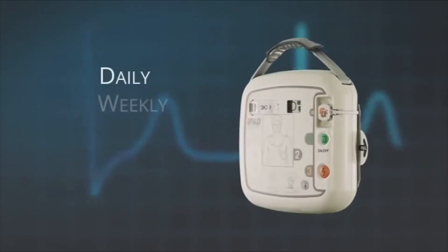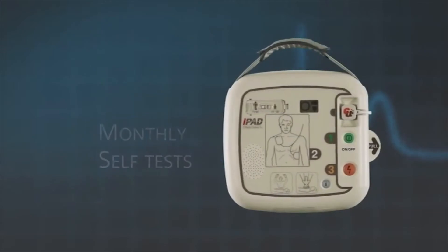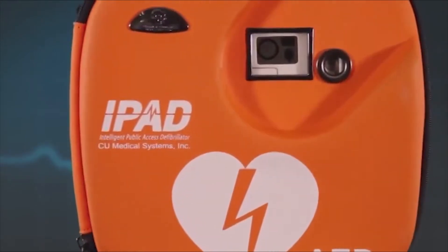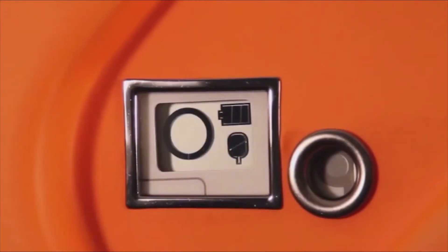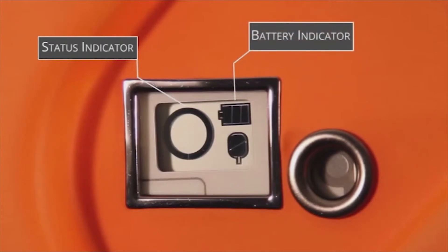The iPad SP1 AED performs a daily, weekly, and monthly self-test. However, it is still important to visually check your AED on a regular basis. This is done simply by looking at the unit status window, which is visible through the carrying case. This window shows three key things: one, a status indicator; two, a battery indicator; three, a pads indicator.